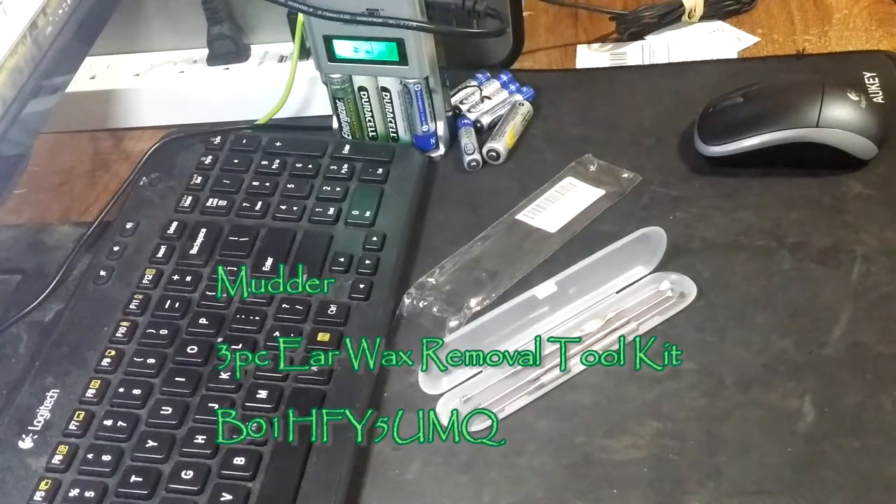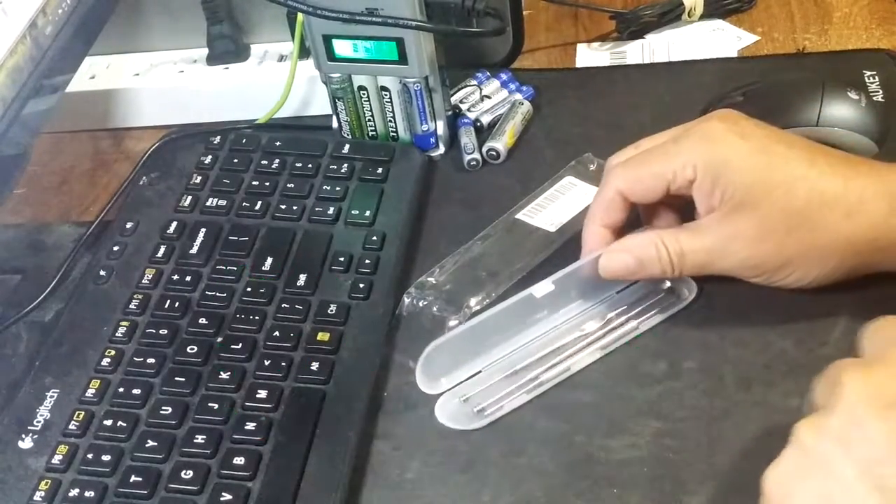Rick, with the best of everything, let's take a look at the Mudder three-piece ear curette earwax removal ear pick with storage box from Mudder. It's made of stainless steel, easy to use with practical double-ended design.